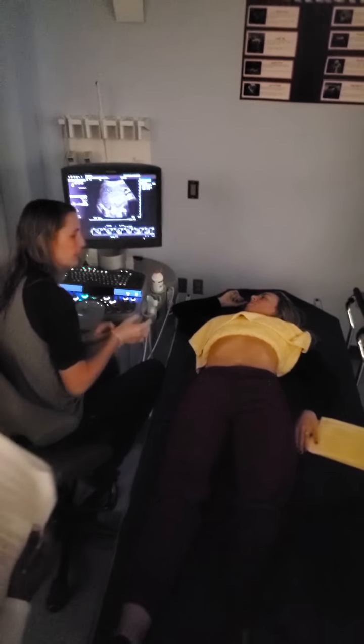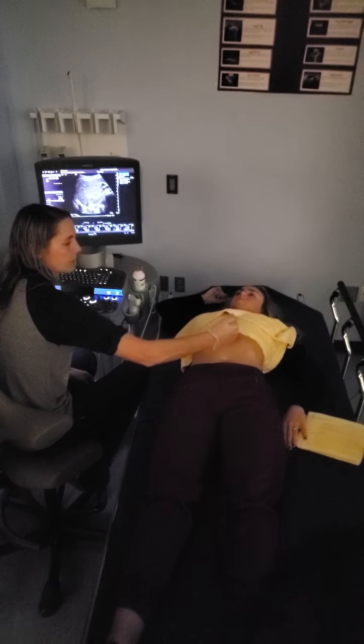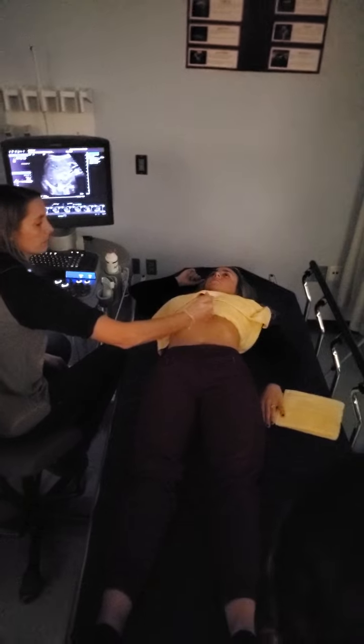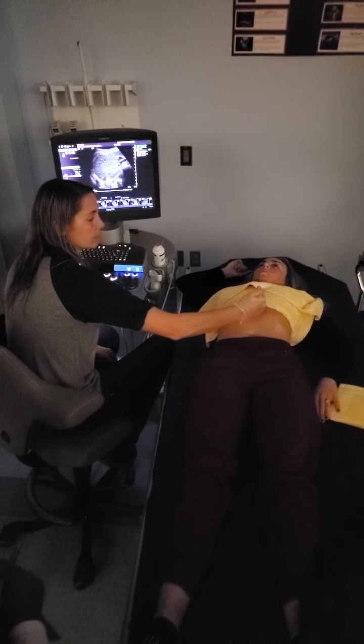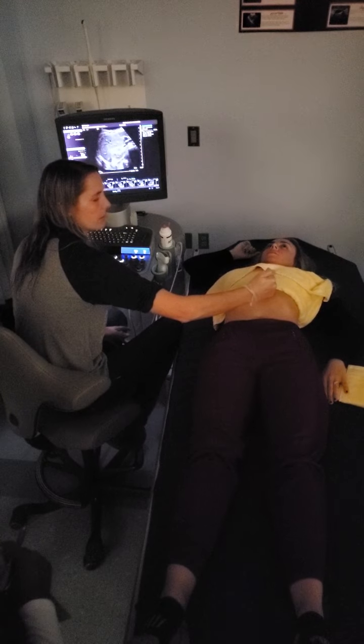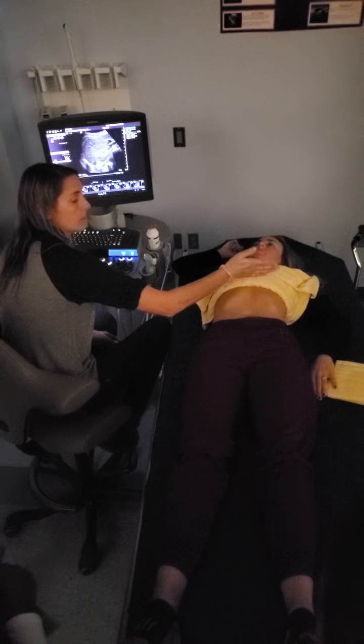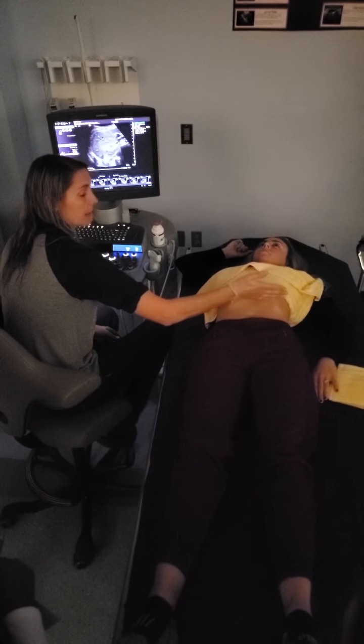Okay, so let's think about this. Let's think about our left. How did we start on our left? Sag. And what's our landmark from medial? IVC, no man's land, maybe aorta, and then just kind of the end of things. And then we did dome, vessel land, pancreas land.